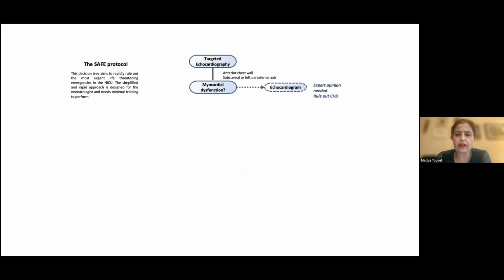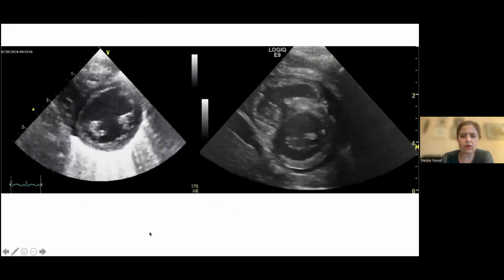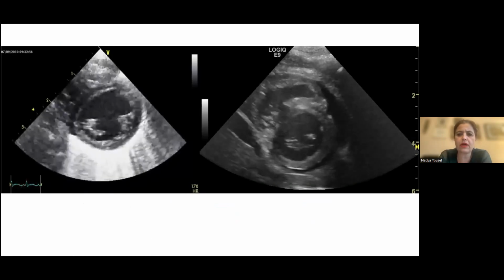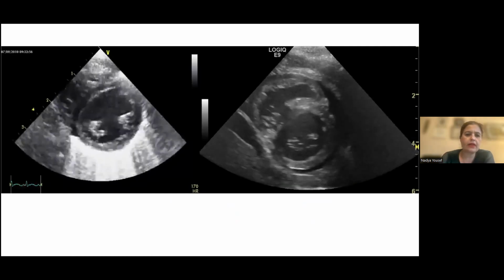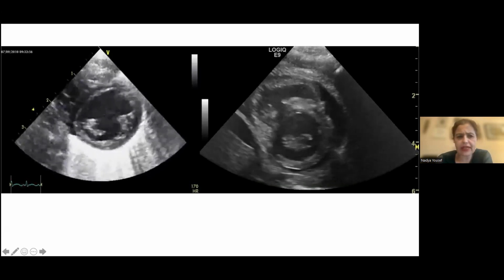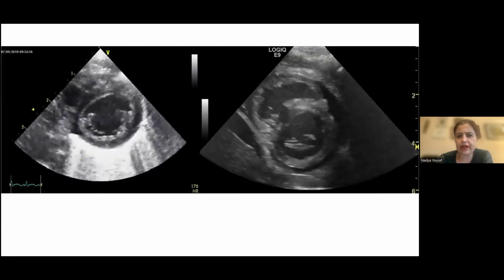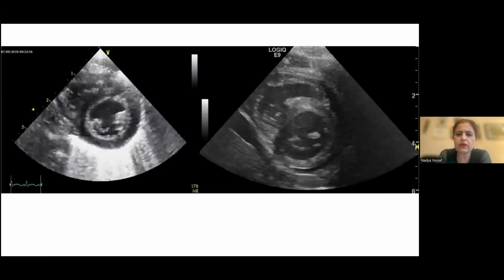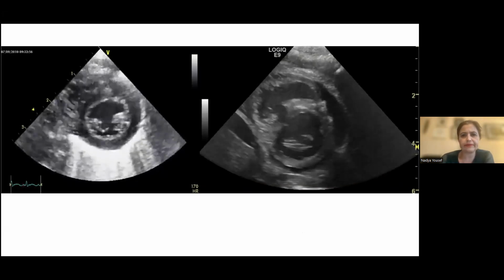So starting off by myocardial dysfunction, what you would need to do is to get a quick idea of how the heart is contracting. You would agree with me, for those of you who are not that used to doing point of care cardiac ultrasound, that here the clip on the left that says V shows a heart that's contracting normally. At least there is no signs of severe dysfunction, whilst the one on the right shows a completely different picture. We don't need a lot of training to see that this heart is not moving that well. So something is wrong here.